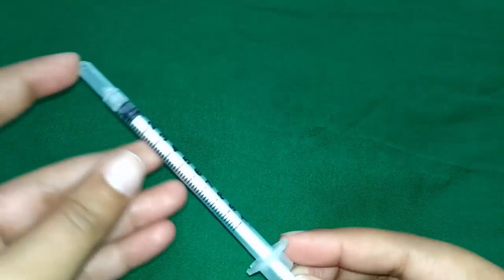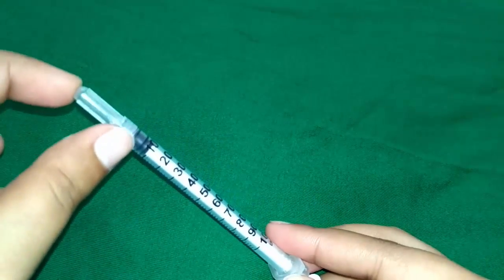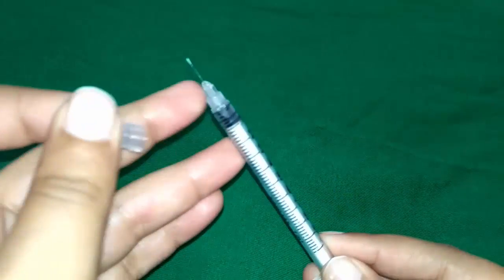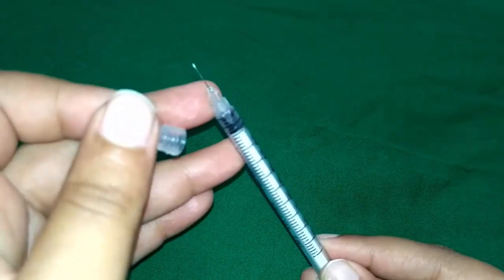Now the parts of the insulin syringe. From the top, this is the cap — it covers and protects the needle before it is used. The needle is short and thin and is covered with a fine layer of silicone.